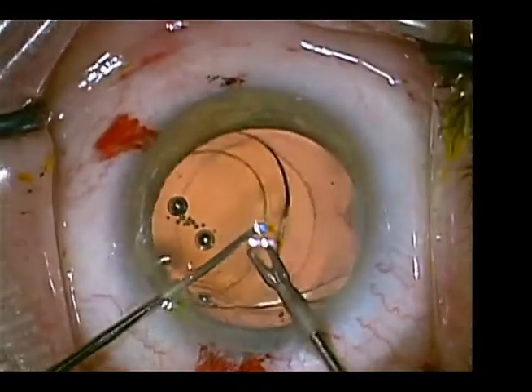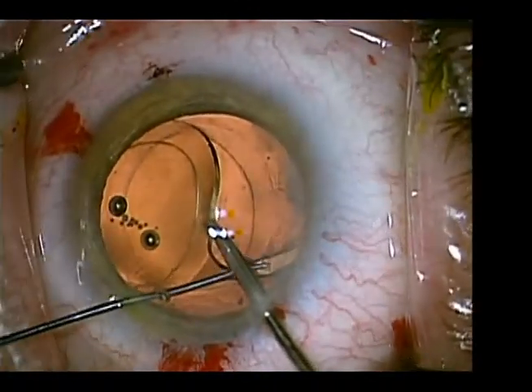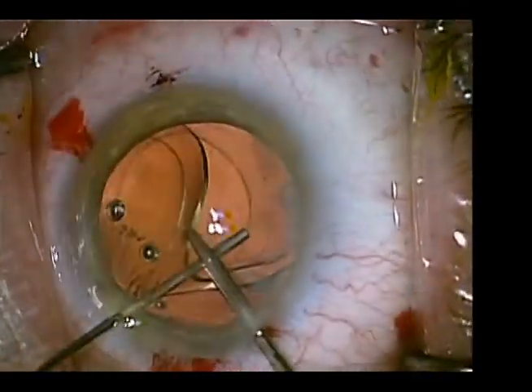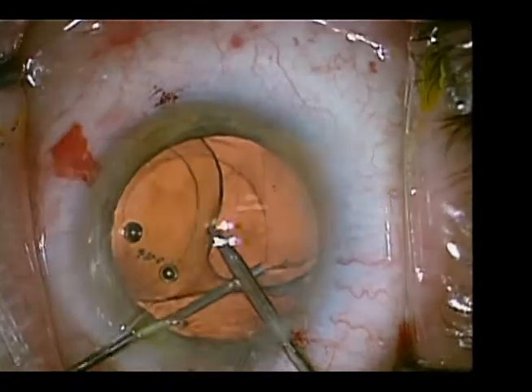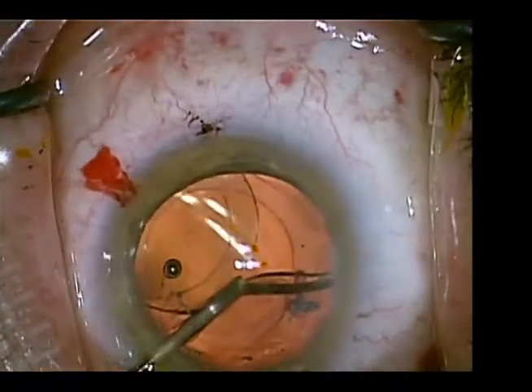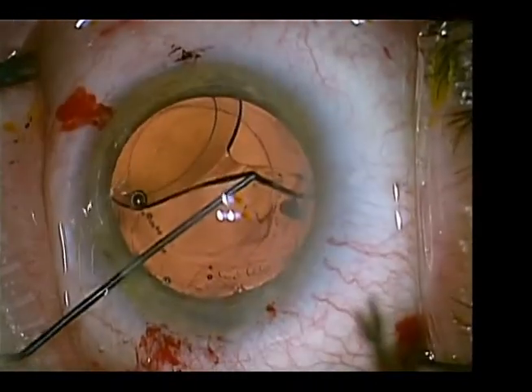Using a Sinskey hook, one edge of the optic is elevated and then grasped with microforceps in order to free the inferior haptic of the single-piece multifocal acrylic lens. Visco dissection and blunt dissection are used in the tunnel created by 3 years of fibroproliferation and regeneration of cortex.